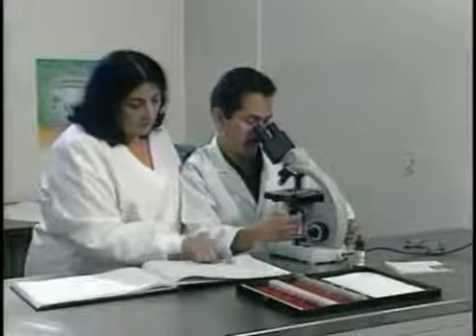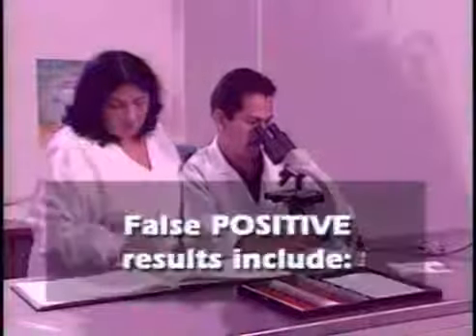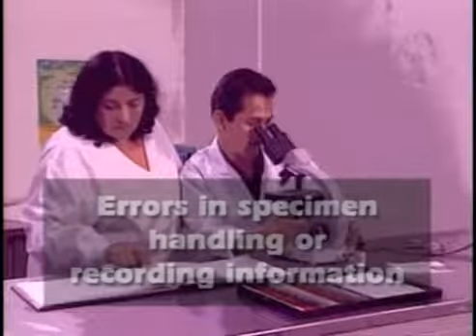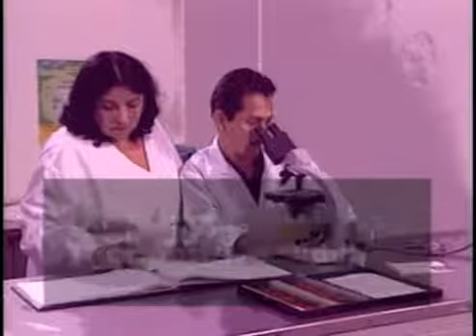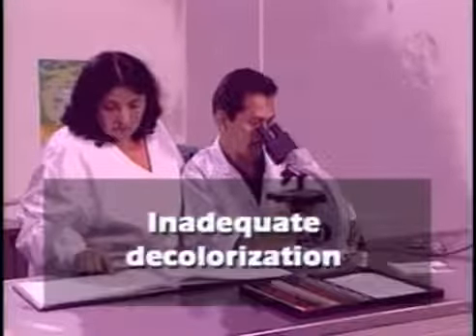Each phase of smear microscopy must be carefully performed. Errors made during any step can lead to incorrect results. Some reasons for false positive results include errors in specimen handling or recording information, reuse of containers or positive slides, unfiltered fuchsin, contaminated immersion oil, and inadequate decolorization.